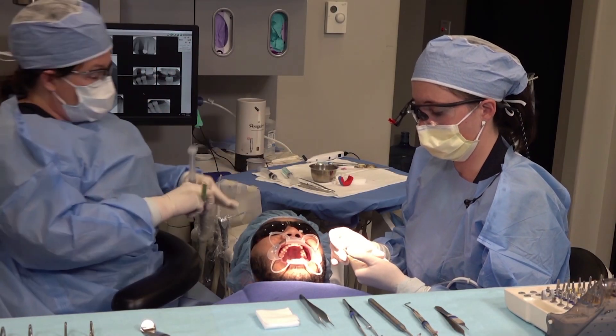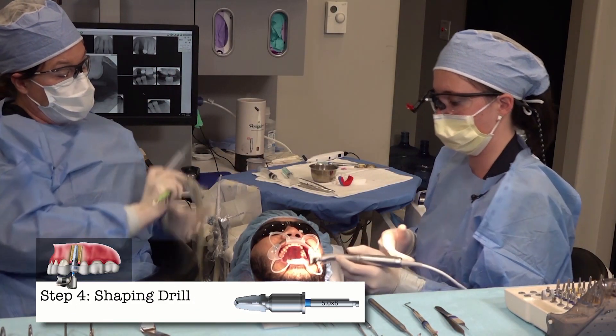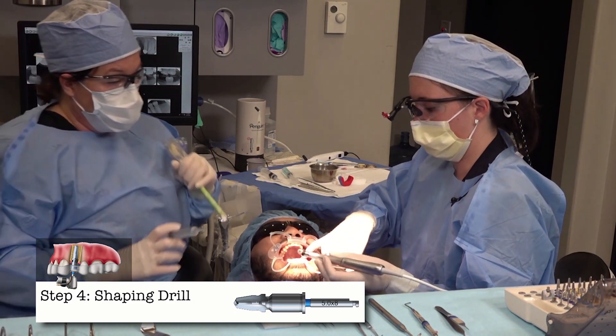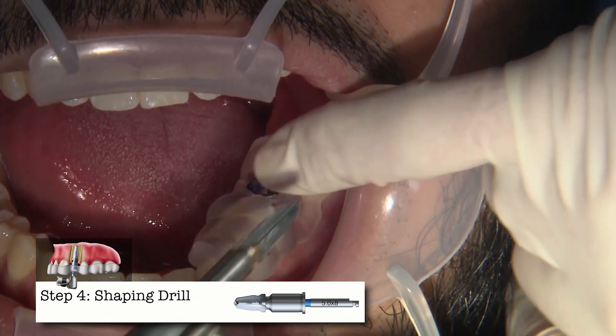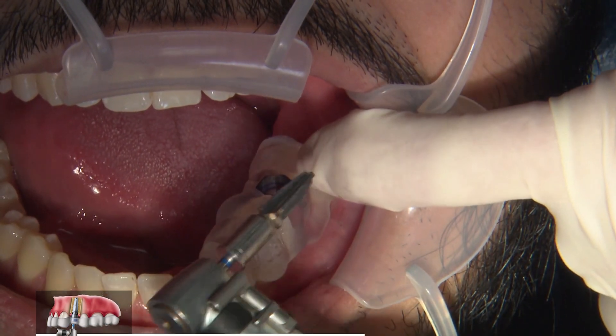Our final drill in our sequence today is the shaping drill. The first drill helped bring us to length; this one is going to bring us to our final length as well as widening our osteotomy.